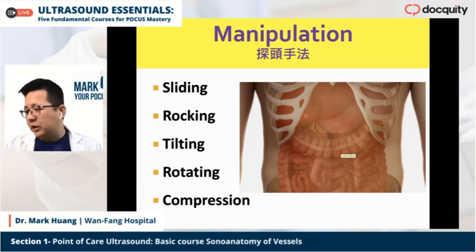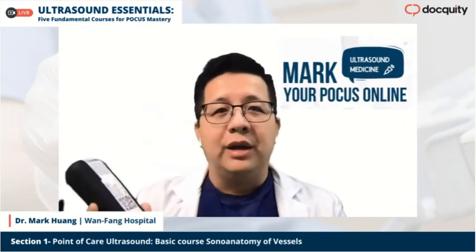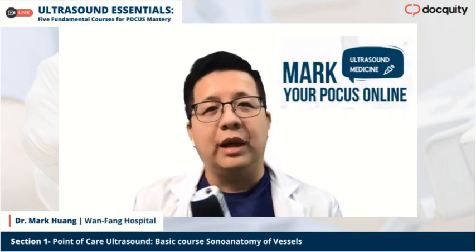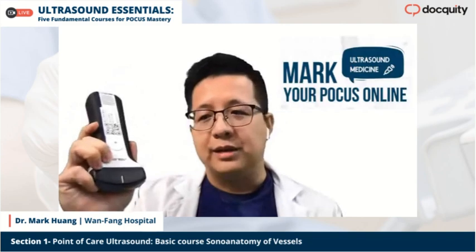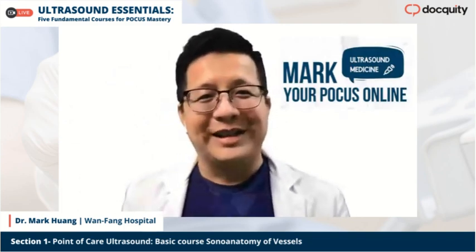Five major manipulations. Let me demonstrate for you. Jessica, if possible, you can turn the channel to my camera so I can demonstrate how to use it. I hope Jessica can hear us.